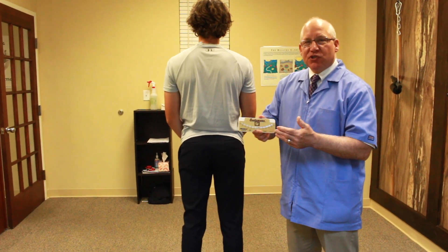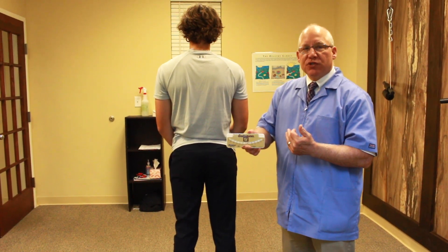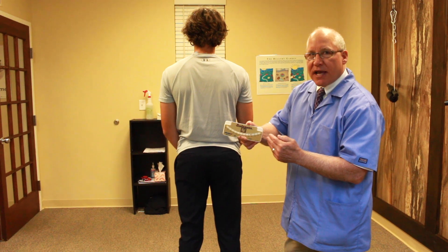The scolimeter helps us to measure scoliosis in between x-rays and also diagnose early scoliosis. So every seven degrees of tilt on the scolimeter equates to 20 degrees on an x-ray.